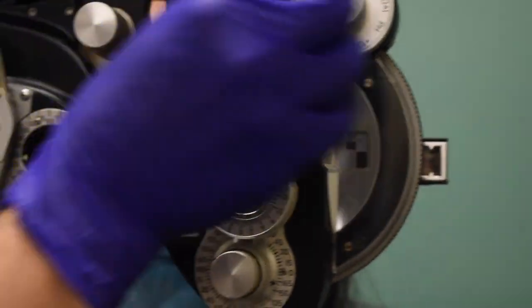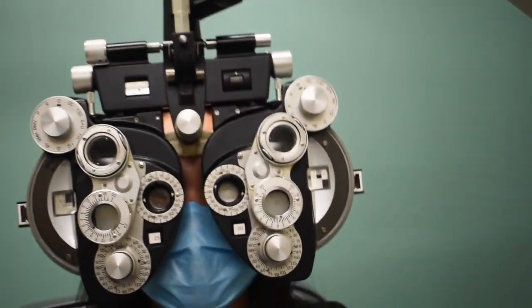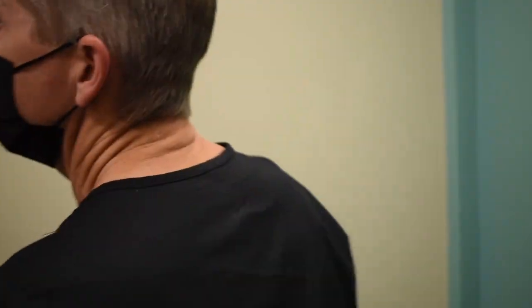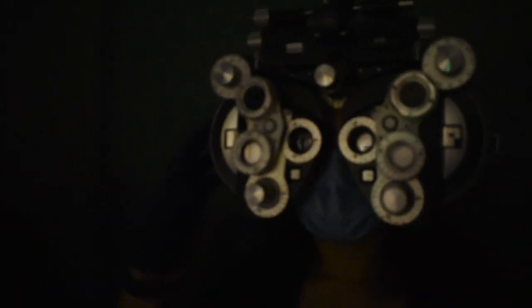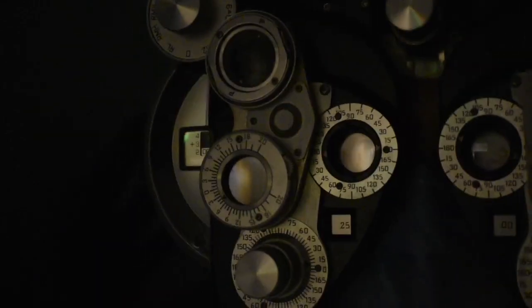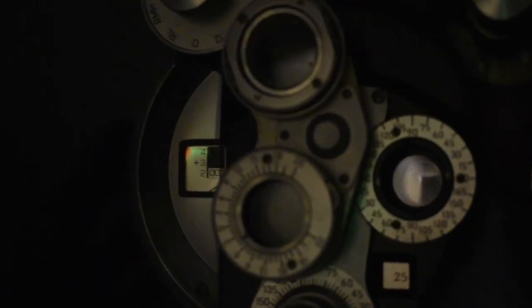And we're going to go ahead and roll right into our bichrome now. We've ensured a 2040 blur. The setup on this again, total room darkness, 2080 isolated line of letters on a red and green eye chart. I want you to tell me which side of the eye chart is darker and slightly more distinct, the red or the green?